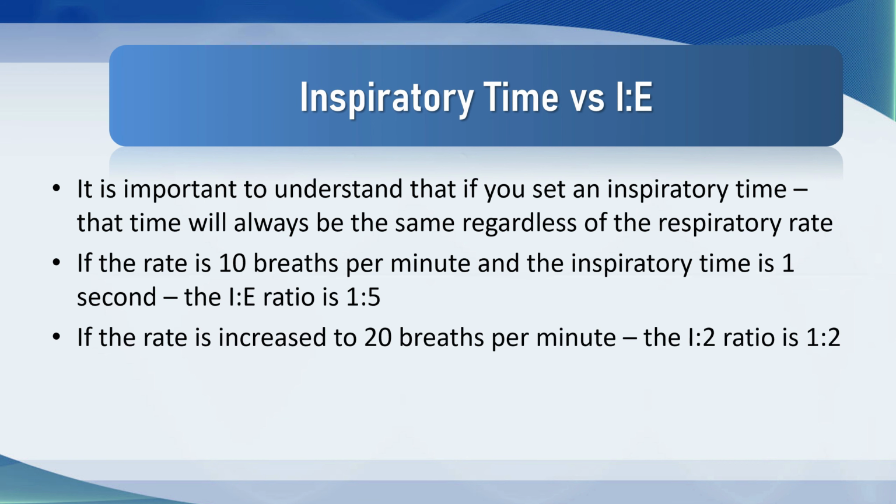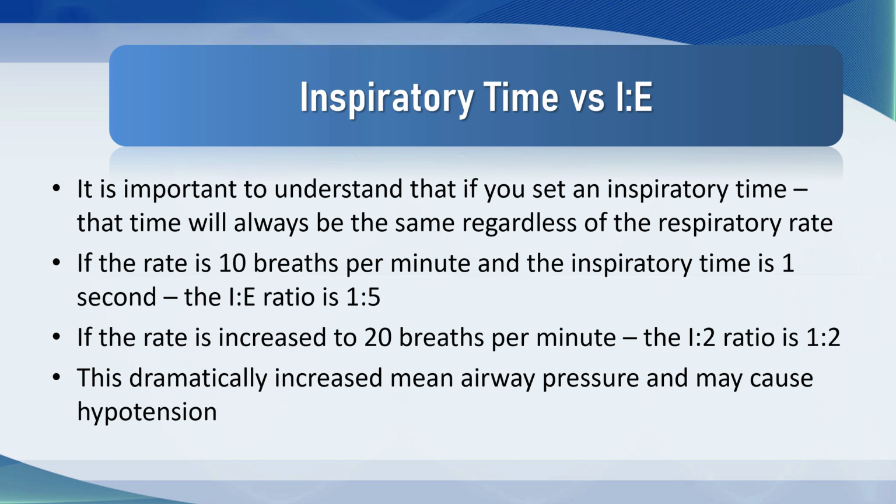If the rate is increased to 20 breaths per minute, the I to E ratio is 1 to 2 because the inspiratory time does not change. This will dramatically increase mean airway pressures and may cause hypotension, so it's worth keeping in mind.